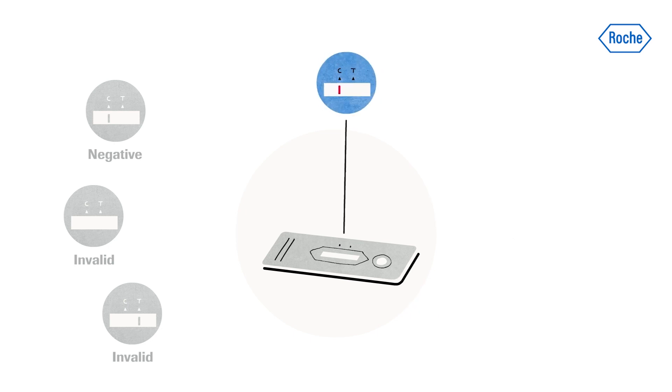In the case of a positive result, a colored line appears in the lower section of the result window. This is the test line T. Even if a test line is very faint or not uniform, the test result should be interpreted as a positive result.